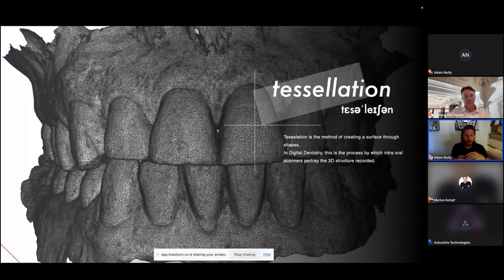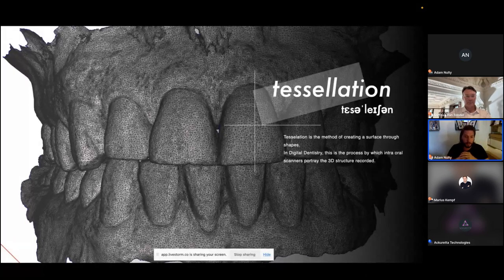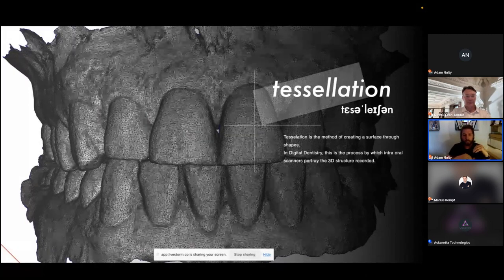How do we get that? Well, first we have to take that solid object, which you can imagine is empty, and make it into a watertight solid object. So something which isn't just a piece of paper that's folded up, but is a concentric, fully surrounded object where the software understands where the boundaries of the solid resin should be. We can then take that to the 3D printer software, which will slice it and convert it.